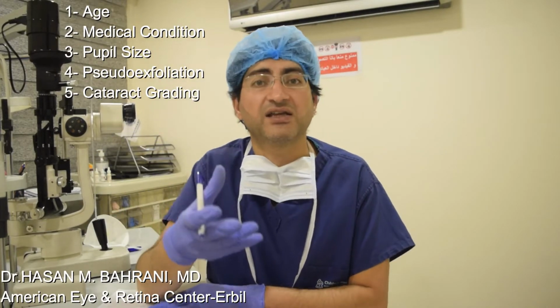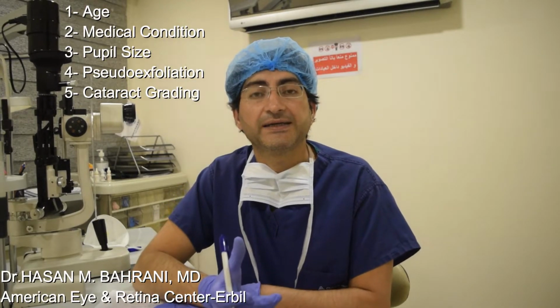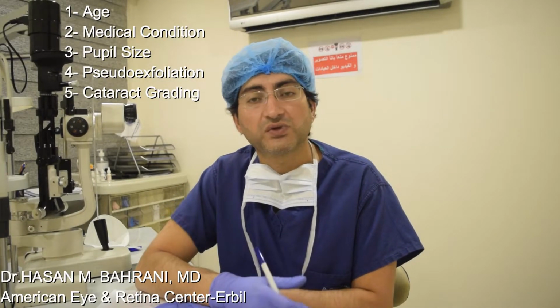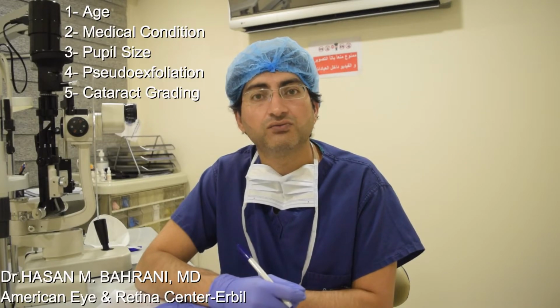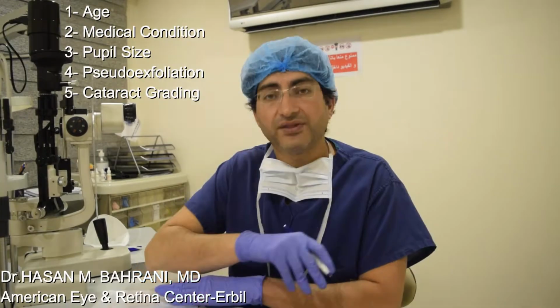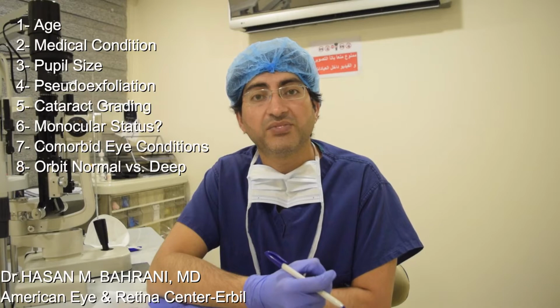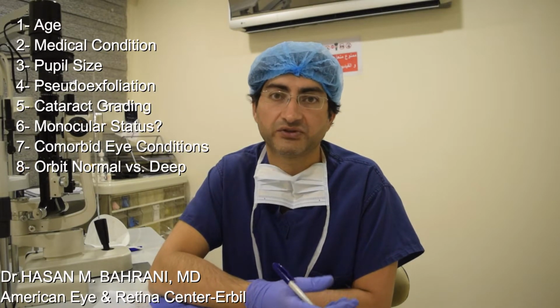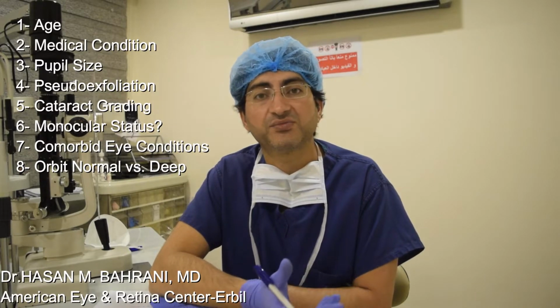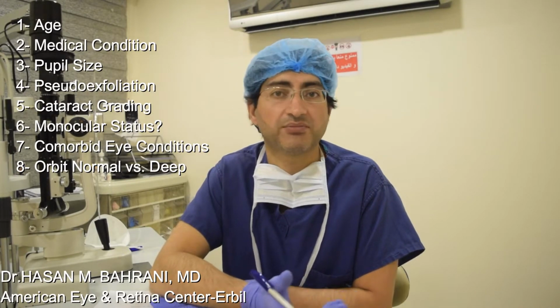My usual technique, my go-to technique, is divide and conquer. So it's really important for me that I get a very good rotation of the lens before I proceed. The grading, we also talked about the presence of posterior polar cataract. That is very important, because with a posterior polar cataract, you may have to refer that to a vitreoretinal surgeon or a more experienced cataract surgeon to make sure that you don't get a dropped lens.